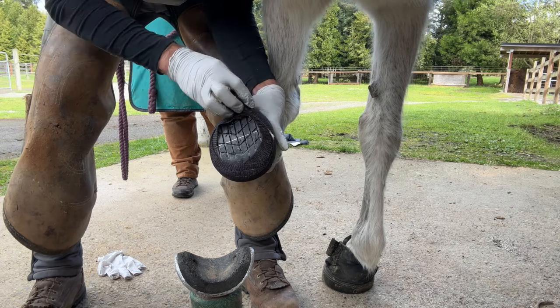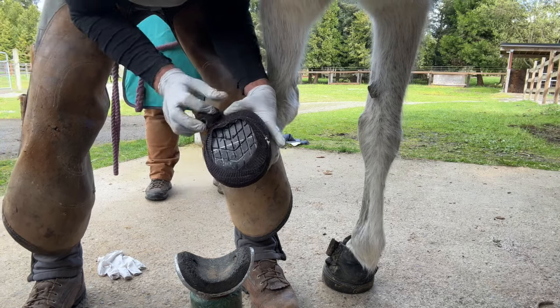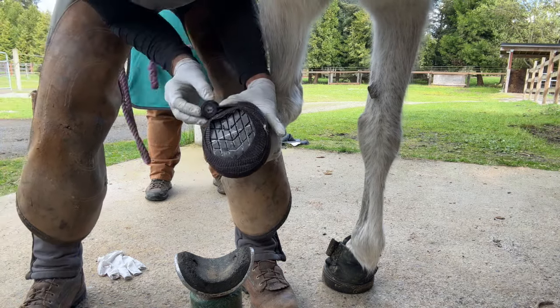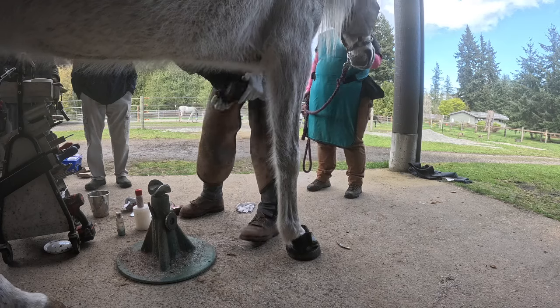Then once I've got a couple wraps like that, I start winding my way up the wall. Okay. So still staying at the heel and kind of keeping up my hoof wall. I want to stay away from the coronary band. Yep. You can cut it away if you get there. Right. And then once I've gotten there, then I start coming back down. Is that a pretty strong material? It is pretty strong.